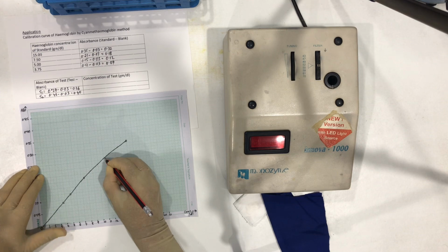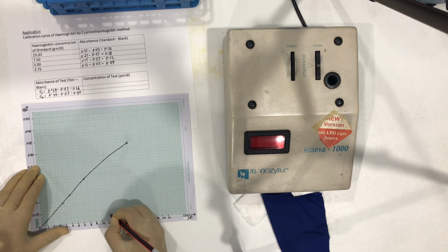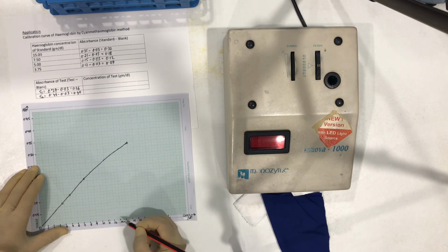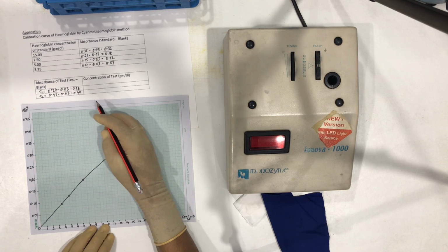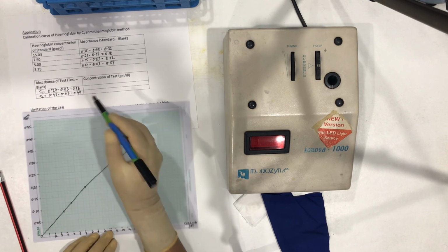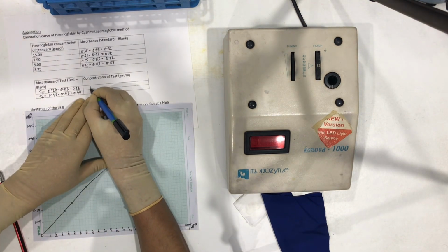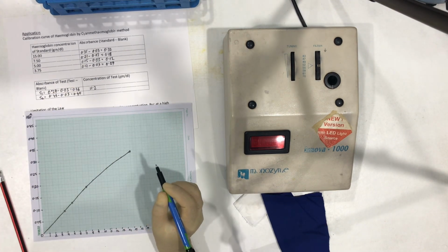Okay, so if I come down, it is coming out here. So sample 1 is giving a concentration of 11.2 gram per deciliter.